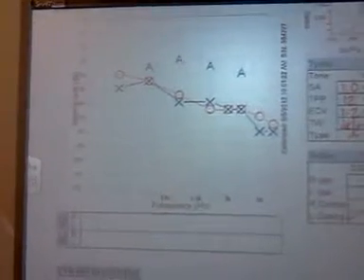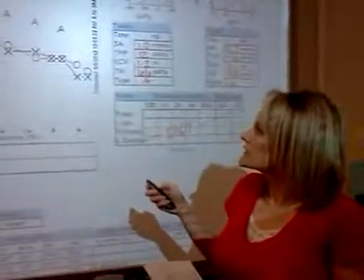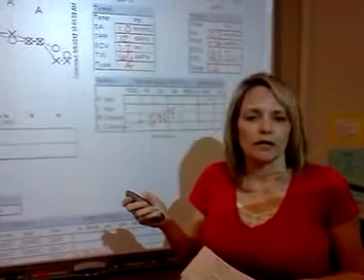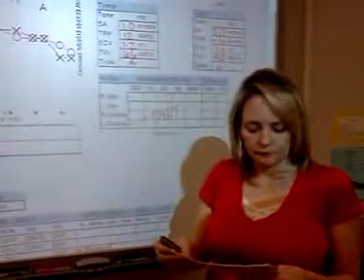We add those 3 numbers together and we get 165. Then we divide by 3. So the reason we divide by 3 is because that's how many numbers we used to add together. And we get the number 55. So in your daughter's right ear, her pure tone average, or PTA, is 55 decibels. We would calculate the left ear in the same way.